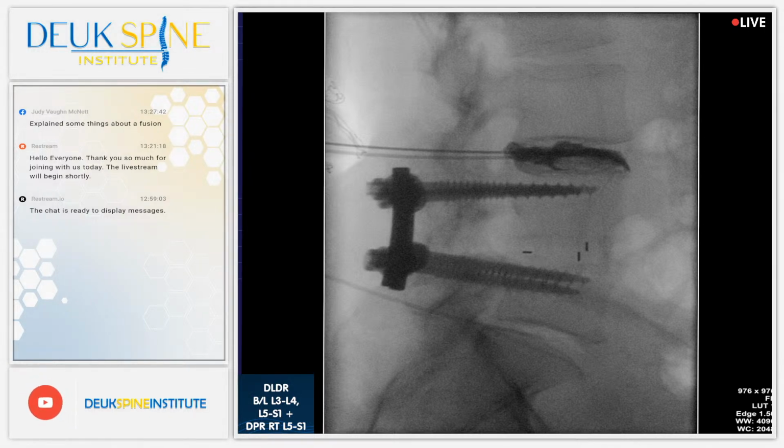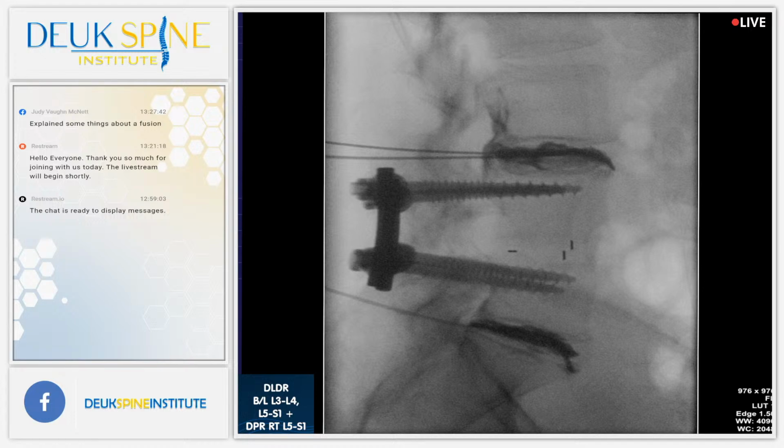Is it better now? Yeah. We did an evocative discogram. All right, how bad is that on a scale of 1 to 10? 10. Is that where you get your pain? Okay. Good news, when you wake up, that pain will be gone permanently.